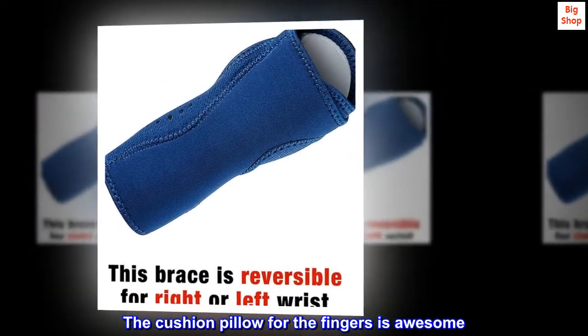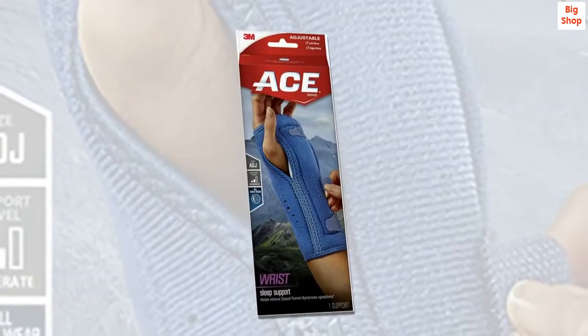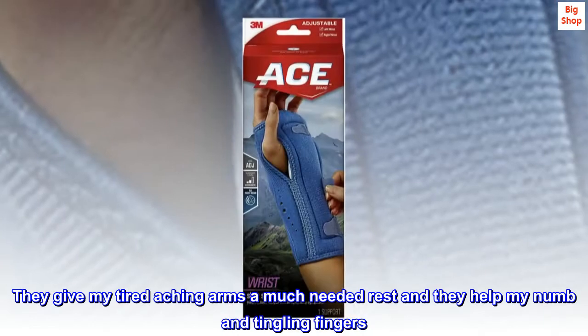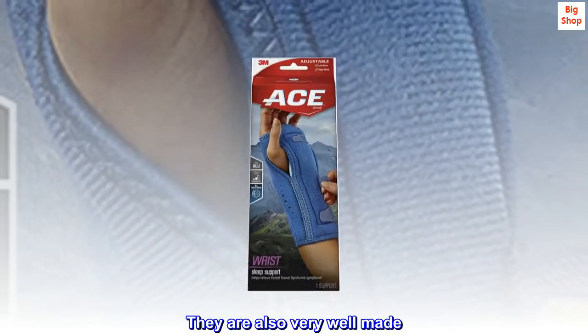The cushion pillow for the fingers is awesome. They give my tired, aching arms a much-needed rest and they help my numb and tingling fingers. They are also very well made.